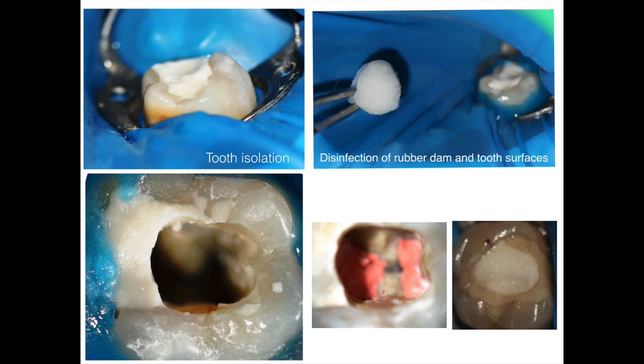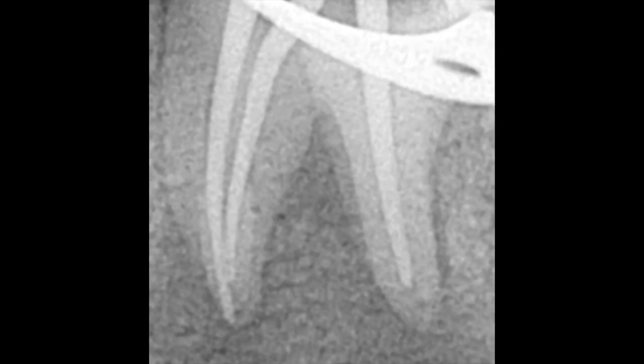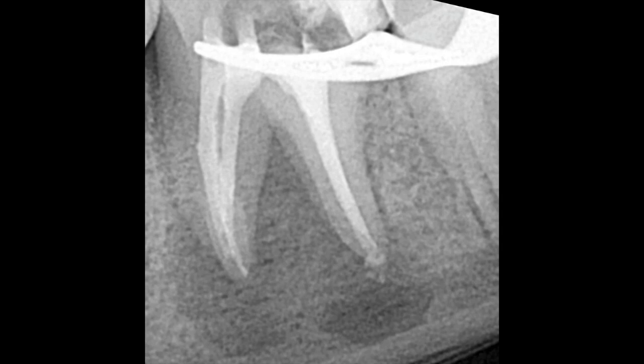Following obturation, glass ionomer was placed and the patient was recalled. The cone fit is shown here, and then the technique involved injecting the sealer directly inside the canal — essentially the squirt technique, using an injection gun to fill the canals. However, this is a very advanced method requiring a microscope so you can see what you're doing. We do not recommend people without a scope and adequate experience to inject directly, as this could result in overfill — especially with the inferior alveolar nerve nearby, which could be very dangerous with any material.